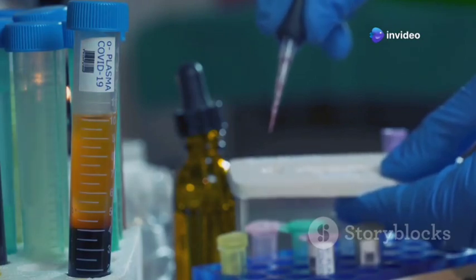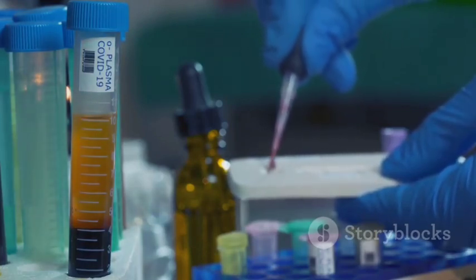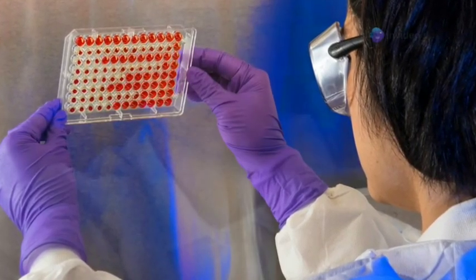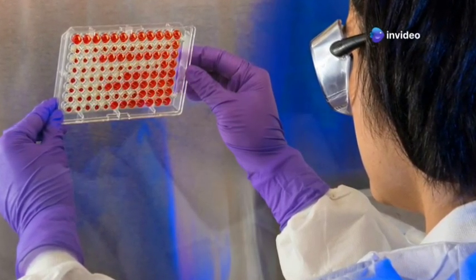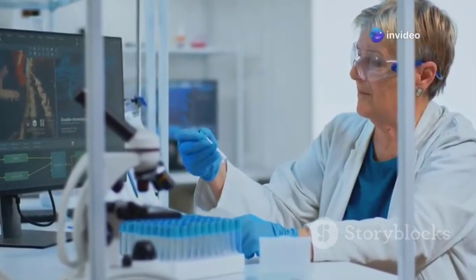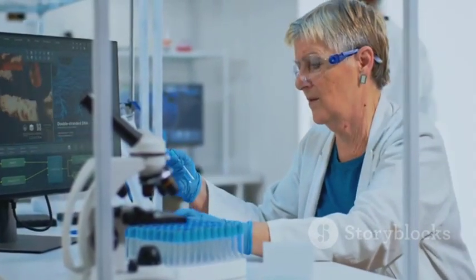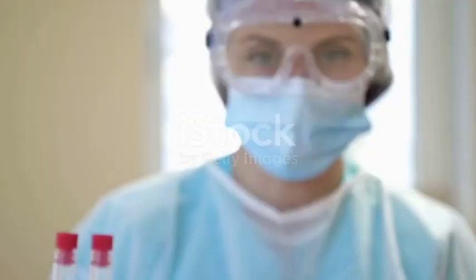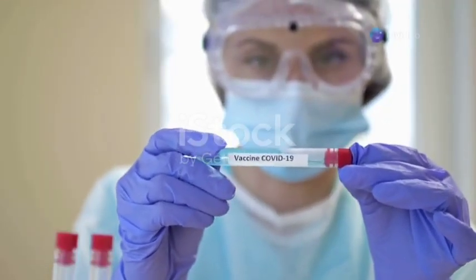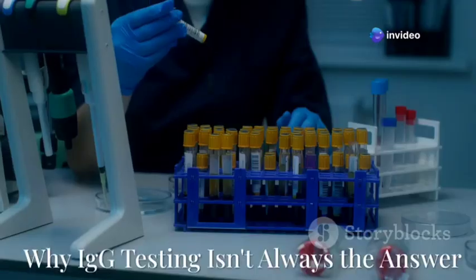ELISA tests for SARS-CoV-2 have been used for various purposes, including diagnosing current infections. ELISA can help identify individuals with an active infection, even if they have mild or no symptoms. ELISA can determine if someone has been previously infected with SARS-CoV-2, even if they never developed symptoms. ELISA can assess the immune response generated by COVID-19 vaccines and track antibody levels over time.